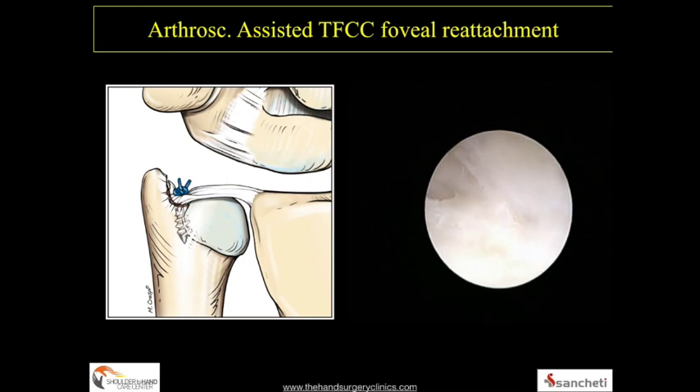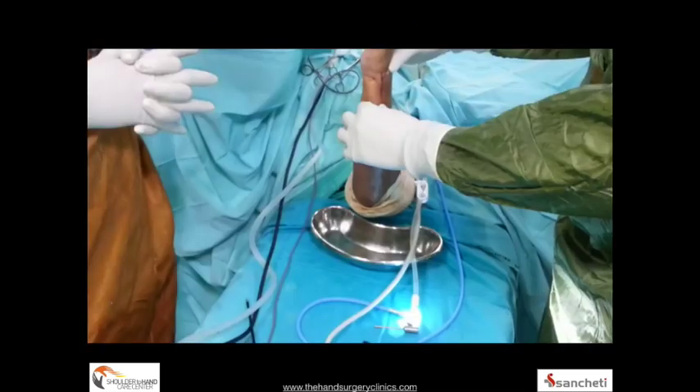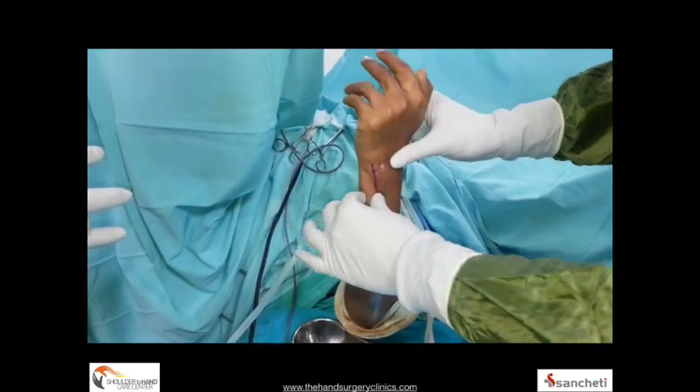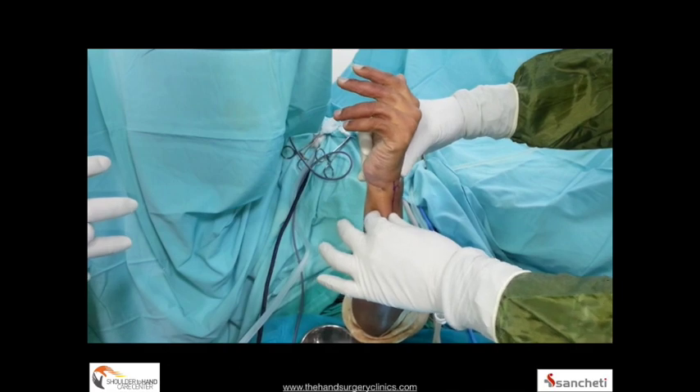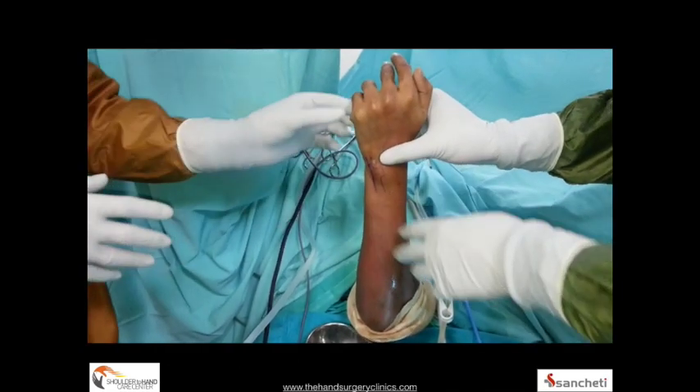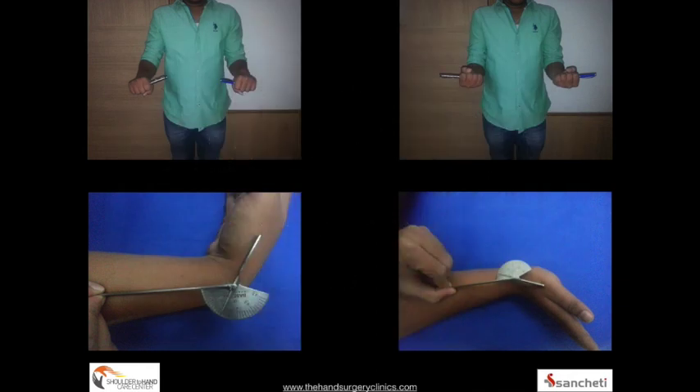Small peripheral tears may also be repaired using non-absorbable sutures or PDS for a capsular ligament repair. In this same patient, a very solid repair has been accomplished and stability has been restored immediately post-operatively with arthroscopic-assisted foveal reinsertion of the TFCC.